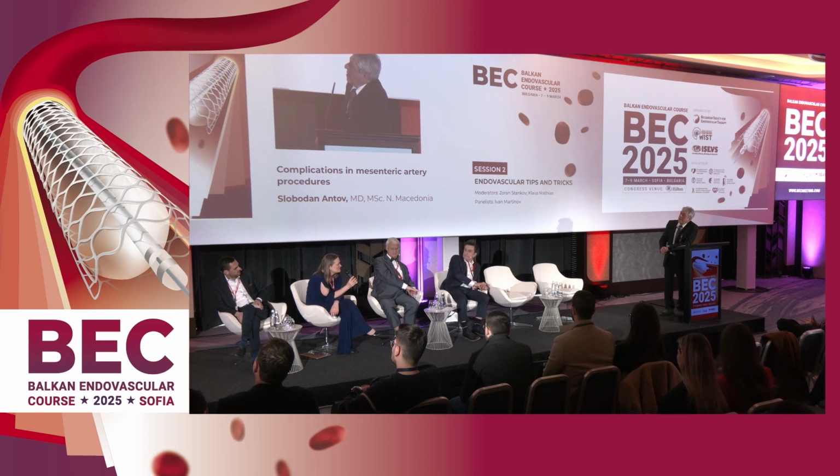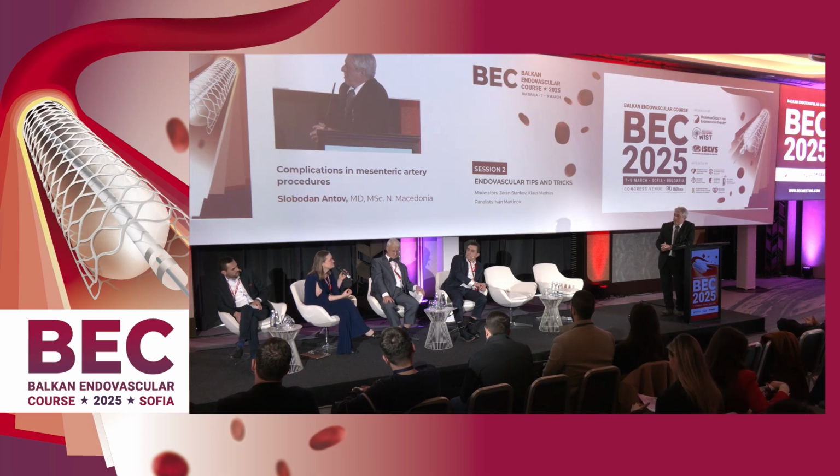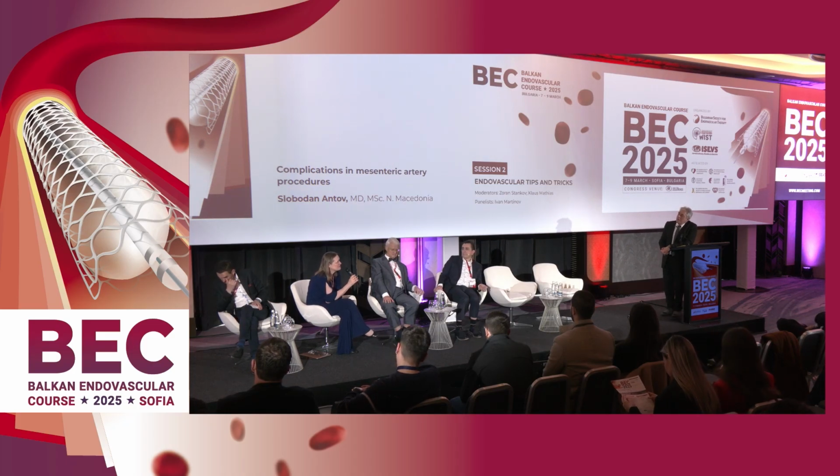Thank you. I would not only look at the stent, but I would look at the stent delivery system, because it is known that any pre-dilatation is a big risk of causing emboli. If you have a stent delivery system that has a very big olive, that is something I would not want to use if I then need to do pre-dilatation. The question is always, which situation are we looking at? I would never, ever, in the acute phase, use a Roadsaver stent, because they seem to be more thrombogenic in the acute phase, and reported rates of acute stent thrombosis have been up to 30% on the table, because the patients are not prepared in advance.